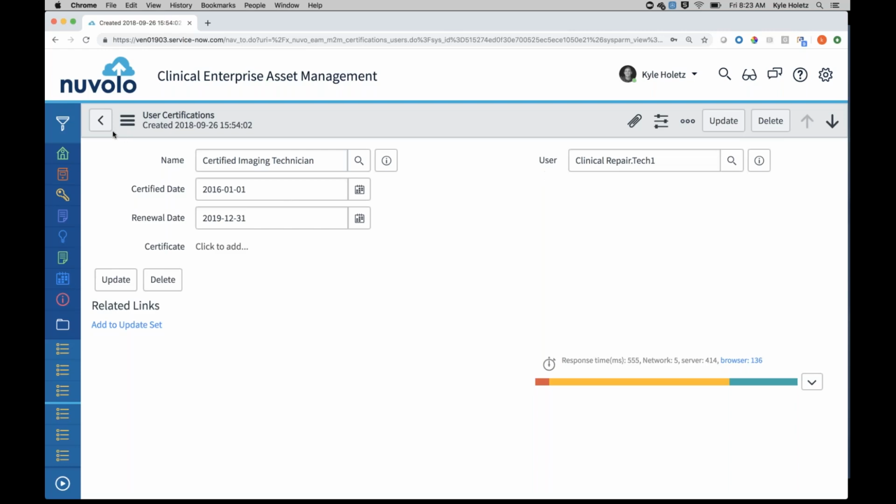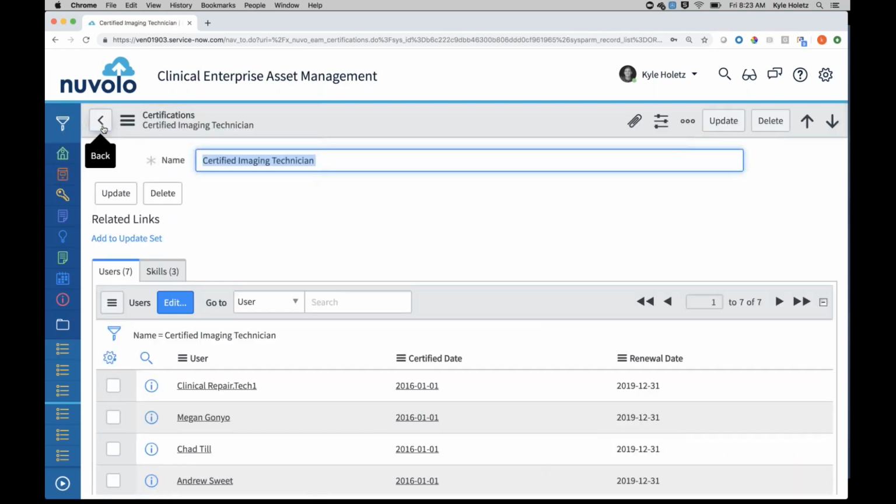Yeah, that's a good point, because even the form example I had up there, the manager review and approval to verify those 5 work orders were actually performed up to the right level. They actually did the steps as part of your annual review of work orders. Again, have that same approval process, review process as part of that.